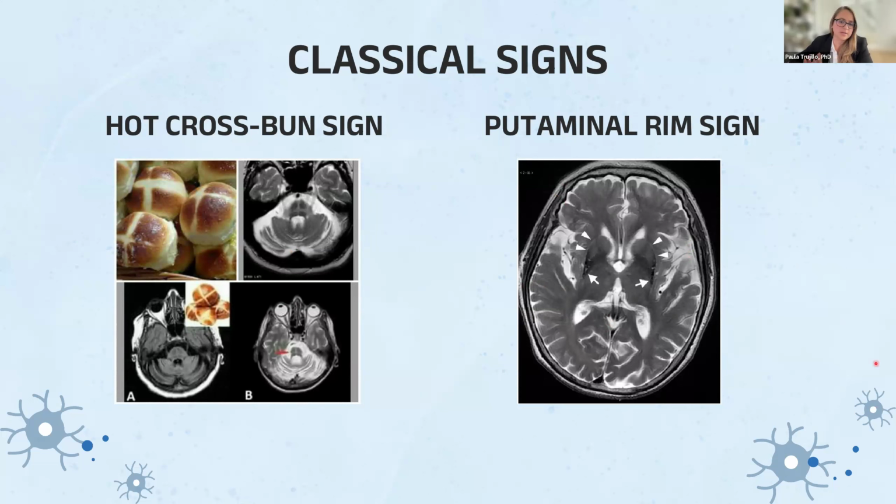And while these signs can help diagnose MSA, they are not always conclusive. They may be seen in other conditions too. Additionally, a combination of these signs can be seen in the majority of MSA patients at different stages of disease. So they may not be evident at initial stages, but eventually at different stages, these may become more apparent and independent of the clinical phenotype.